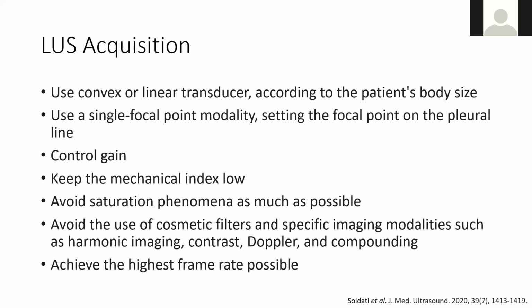And then for the more experienced practitioner, there are recommendations with regards to things like mechanical index, saturation phenomena, cosmetic filters, etc. Speaking with Dr. Yu, my understanding is that cosmetic filters are found in many abdominal exam presets, but with our newer ultrasound machines, these are turned off, or we have the ability to turn them off in most lung and thoracic presets. But the downside of turning off the filters is that it can reduce the quality of pleural effusion images.